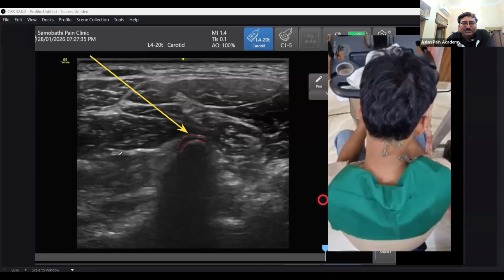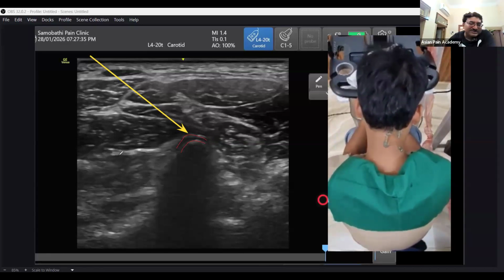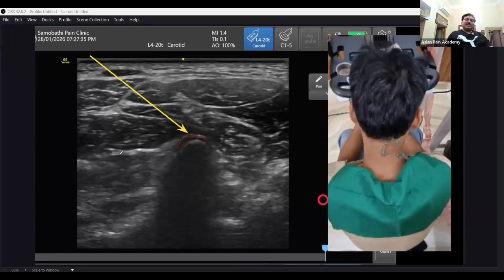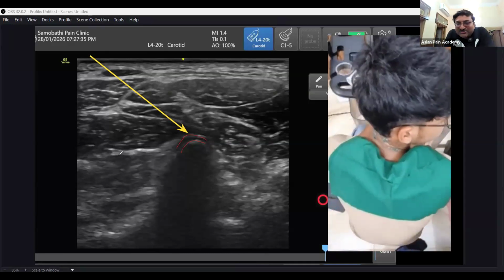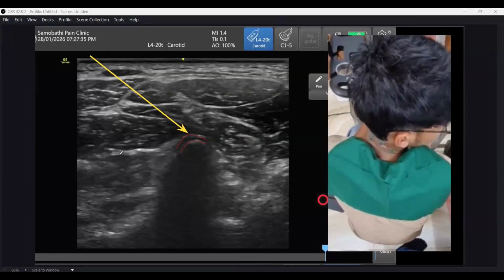All right, understood? Which needle do you use? This normal needle or any special? Always, echogenic needles are there. That gives you a little bit better visibility. But in most common cases, we use the normal Quincke spinal needle because that is much, much cheaper.